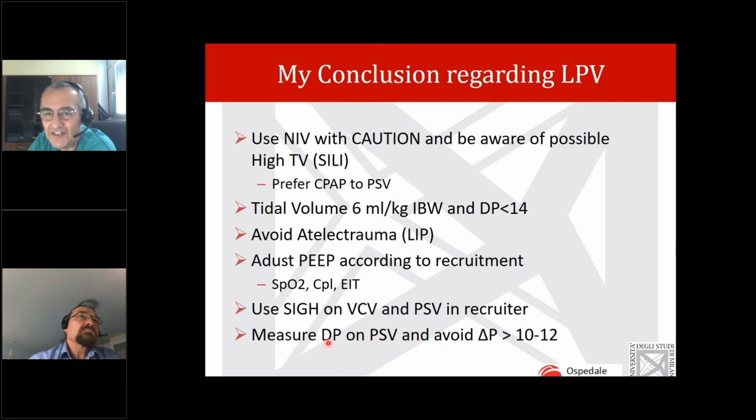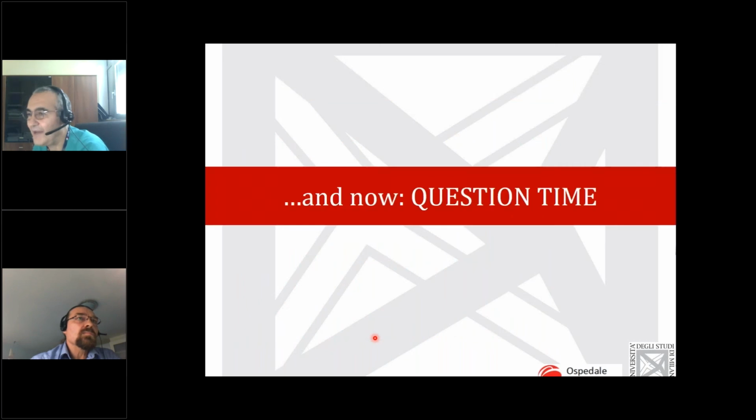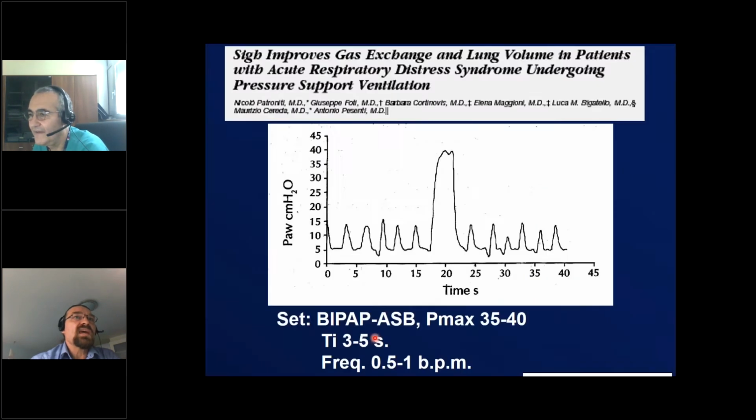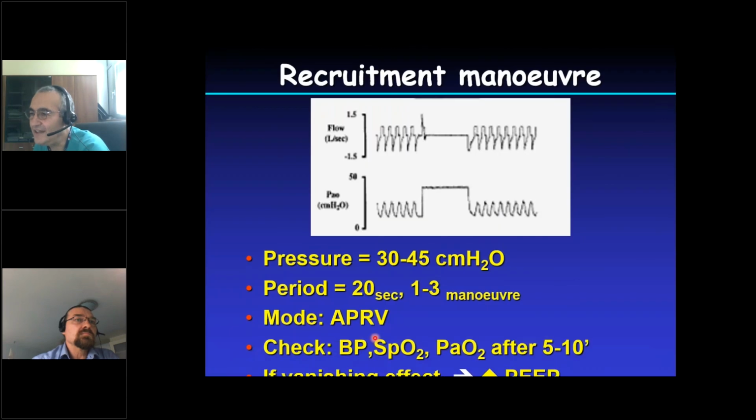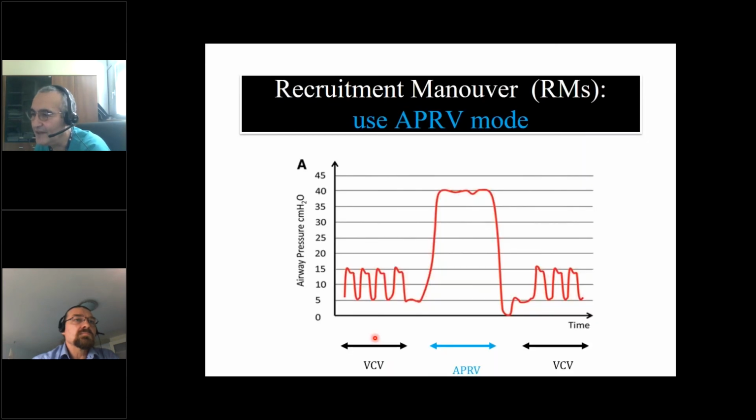Yes, this is an APRV modality used only on one breath, to do the recruitment. The modality is APRV. Only in this phase is APRV. So volume control, one breath on APRV, 20 seconds long, and then go back to volume control.